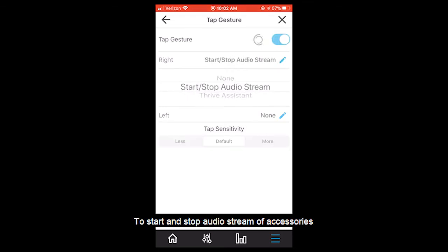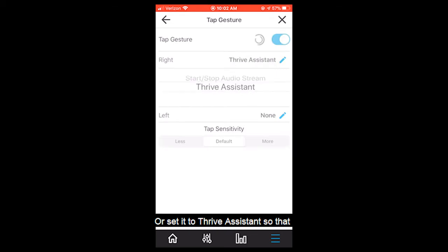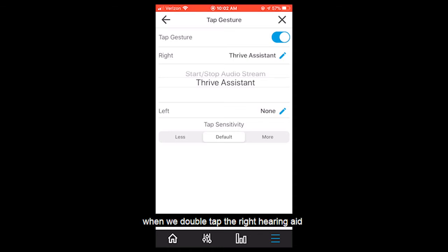We can set the double tap gesture to start and stop audio stream of accessories such as remote microphones or TV streamers, or set it to Thrive Assistant so that when we double tap the right hearing aid we can ask it questions such as what's the weather going to be today or who won the World Series in a specific year. Let's leave the right set to Thrive Assistant.